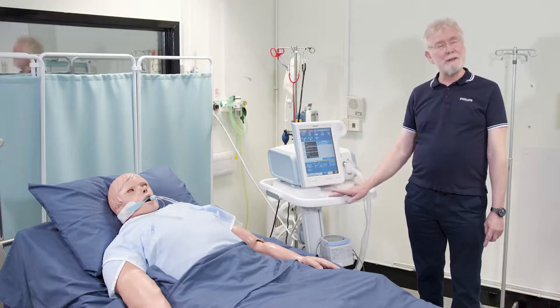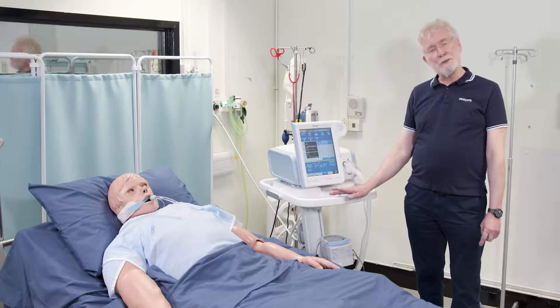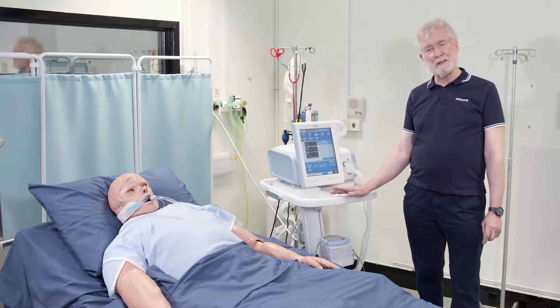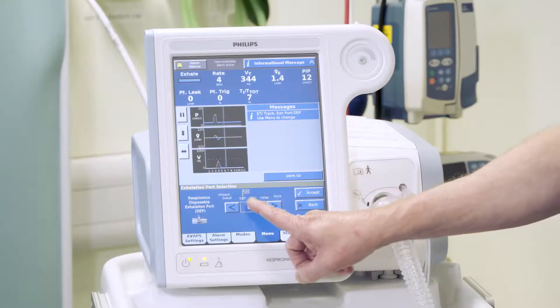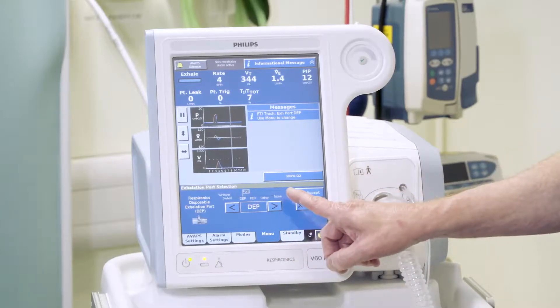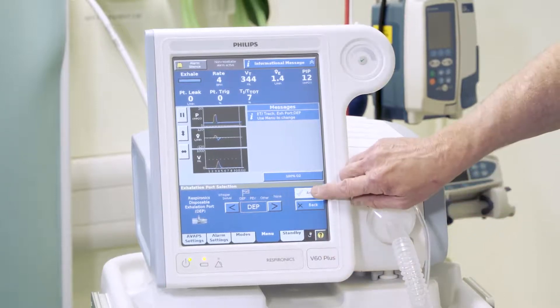In terms of the interface, if you're doing invasive ventilation you will use the same circuit setup as you would for non-invasive — in other words, a passive exhalation port. So you will look for DEP, disposable exhalation port, and press accept.